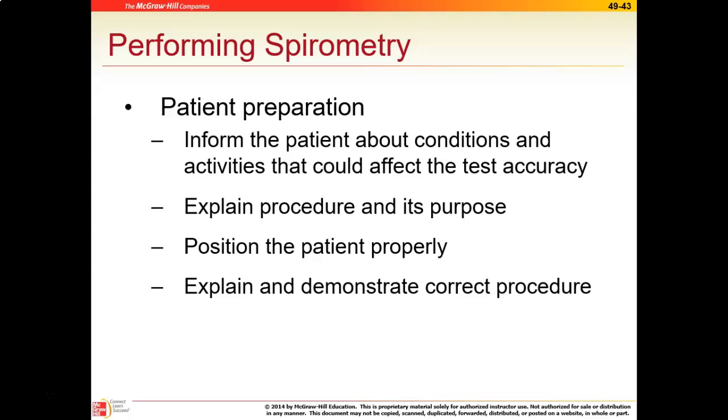And so you would not want to administer the test if someone is using those substances. And then smoking right before would not be a good idea. You want to at least hold off. You'd want to consult with your primary care physician, but you'd want to know how much time there is in between having a cigarette and actually doing this test. And the one thing is that this test is frequently used for people with COPD. And so a lot of people using this are smokers, but you'd want to know if they had smoked within the past hour or had a heavy meal within the past hour. Okay, so those are some guidelines on what to ask as far as should we proceed forward. If someone had one of these things, you'd want to at least consult with a physician before doing the test.